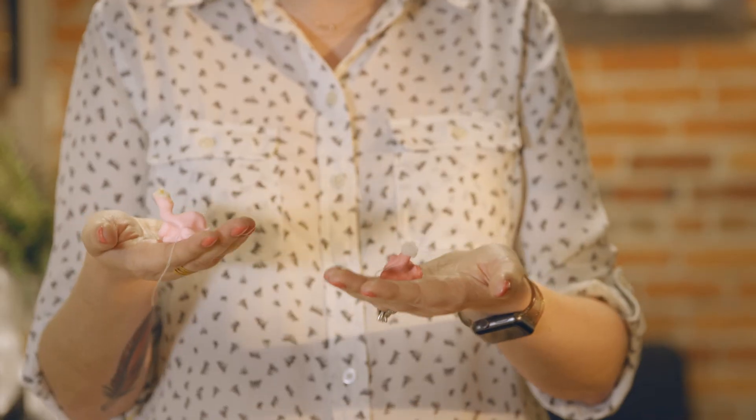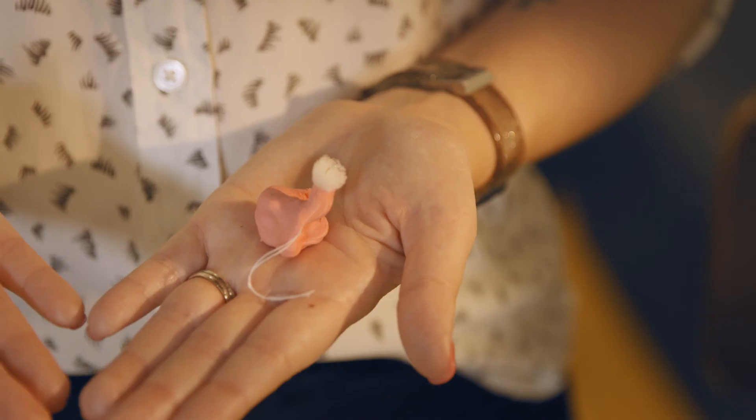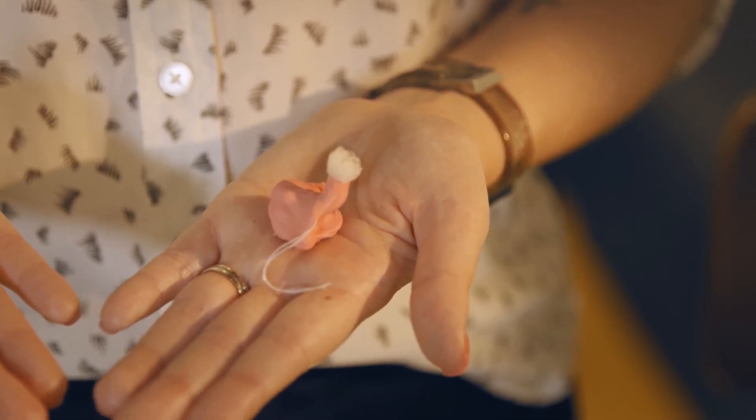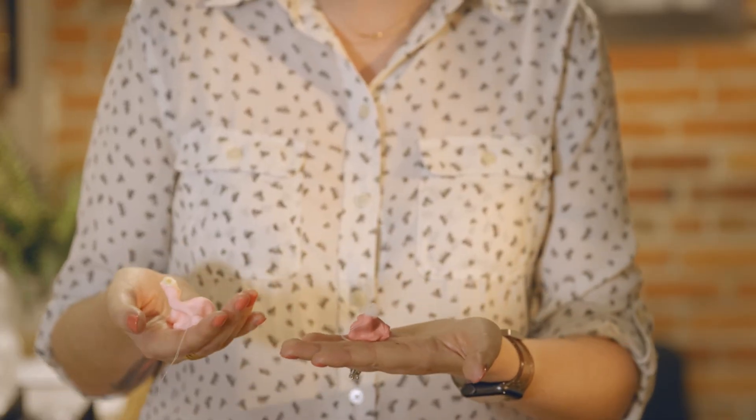We're all done with Zach's ear impressions and they look great. On the contrary, from time to time we receive impressions from customers that don't look so great — here's an example. This set was a little too shallow, it didn't get the outer ear, it's also missing part of the helix, and the canal is a bit too short. In this case we would request a new set.